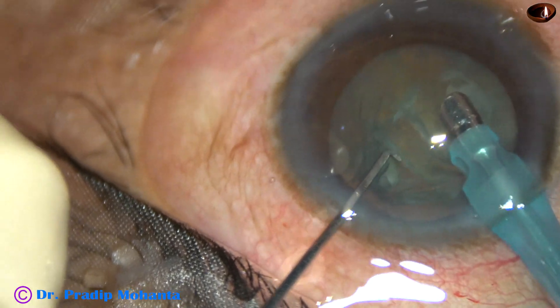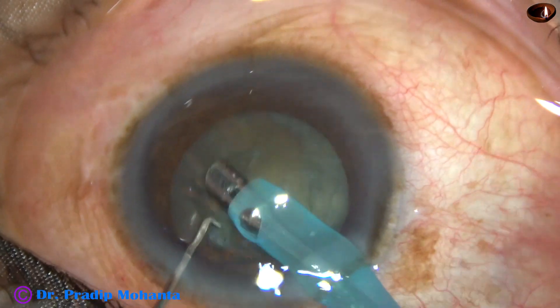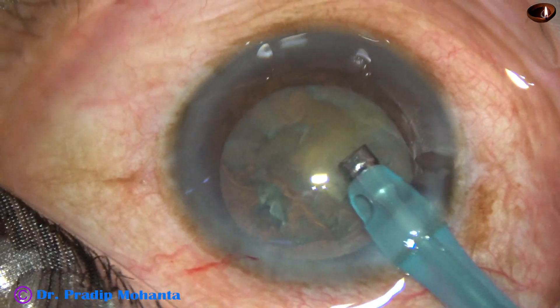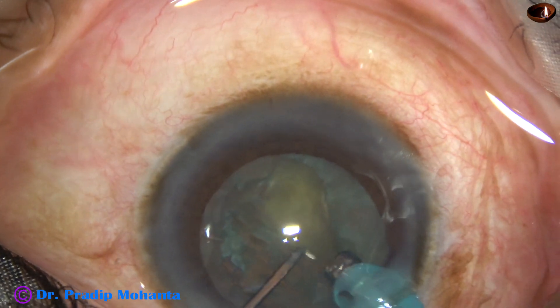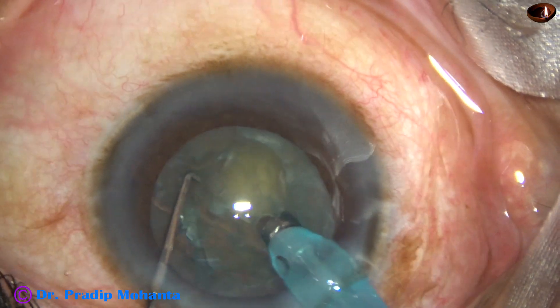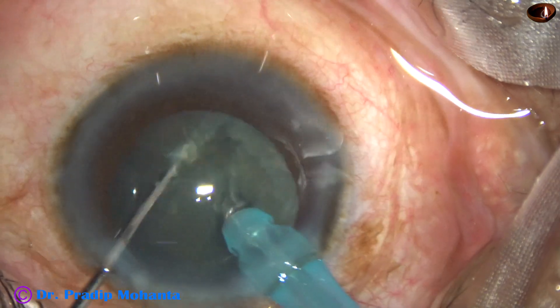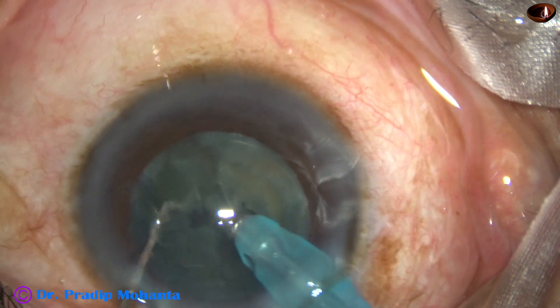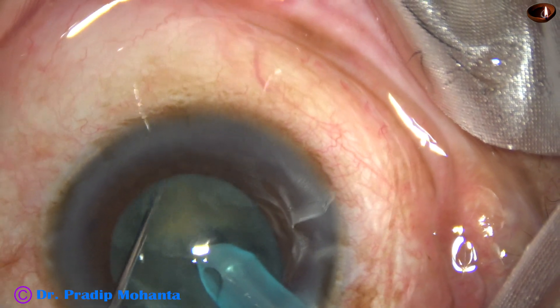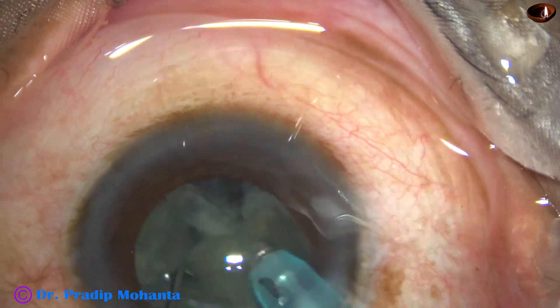The handpiece goes into the anterior chamber. Some superficial cortical lens matter is removed. The handpiece is turned — the bevel is up. Now a pit is dug just in front of the main incision. It is deep but small. Now the tip just supports the lens mass in front, and the chopper divides the nucleus into two heminuclei. The heminucleus on the left side has been chopped, and the heminucleus on the right side is brought in front and also chopped into two fragments. The phaco tip supports the lens mass in front in irrigation.